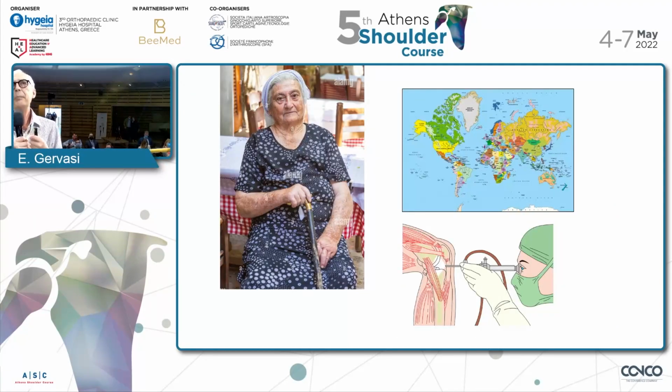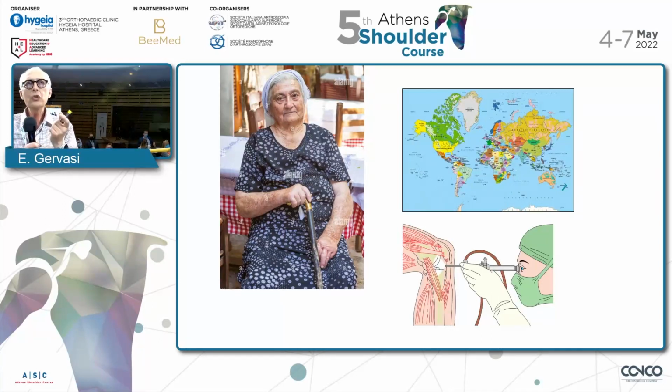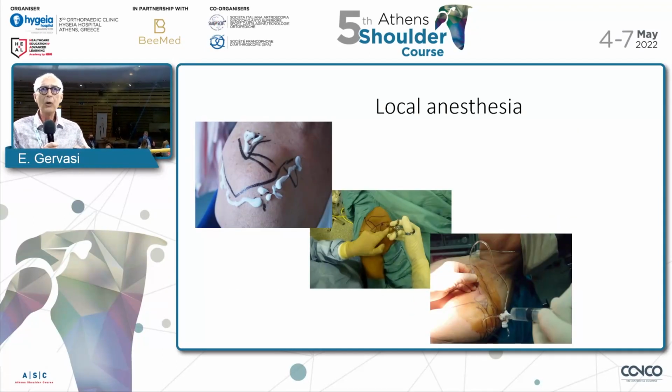But what to do when the person is elderly, not willing to do physiotherapy, has no money to go to a surgeon, or is probably in an area where shoulder surgery is not so evolved as in our countries? What to do? This is the idea that led me to go to the balloon. It should be a device that can be inserted easily everywhere, even if there is not a dedicated surgeon, and with local anesthesia. And this is the work I did.